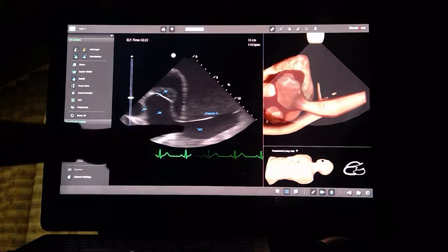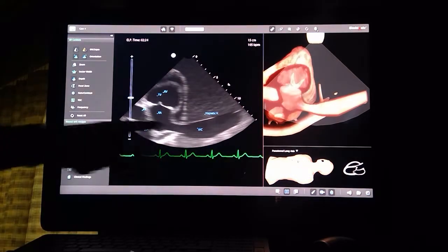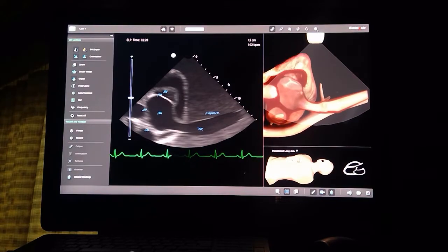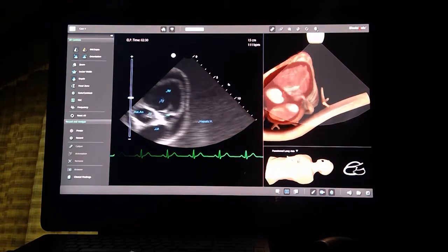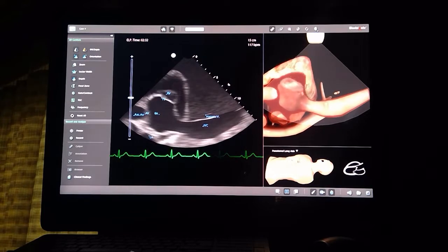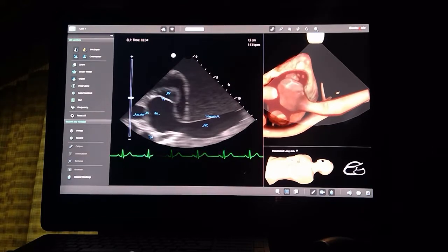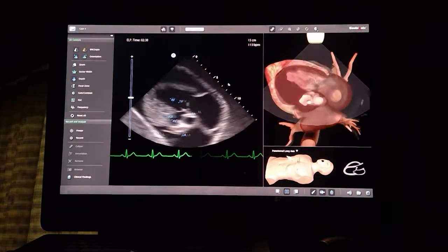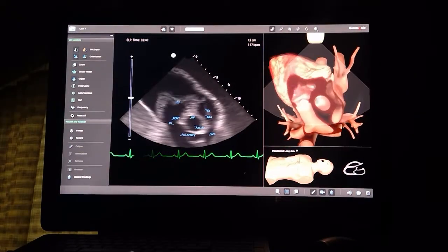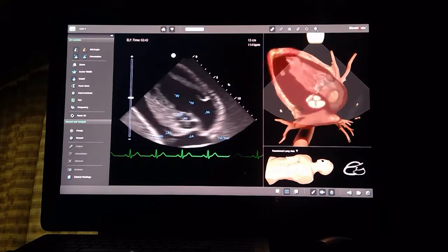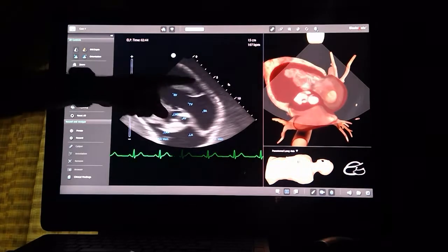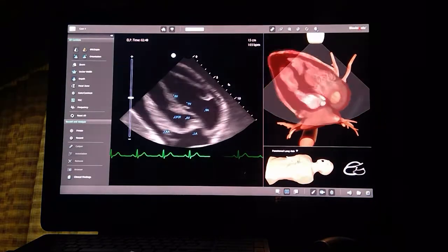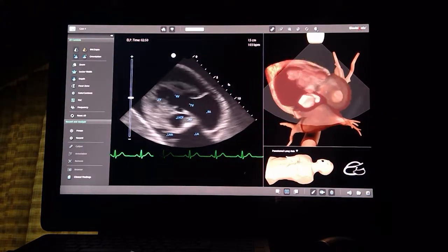Looking at the IVC, it appears dilated and is not moving with respiration, which is a sign that right atrial pressure is high. All in all, this is a case of cardiac tamponade due to excessive pericardial fluid, most likely due to malignancy.